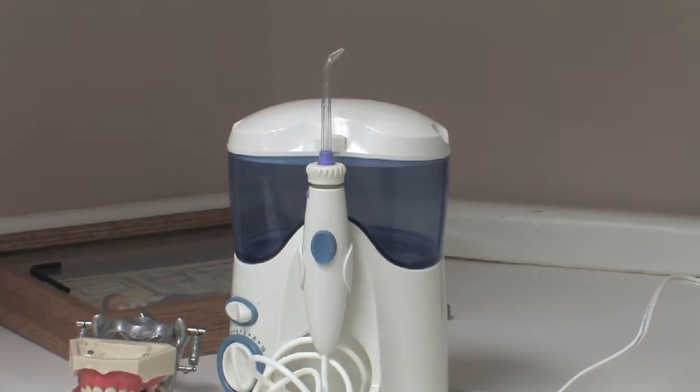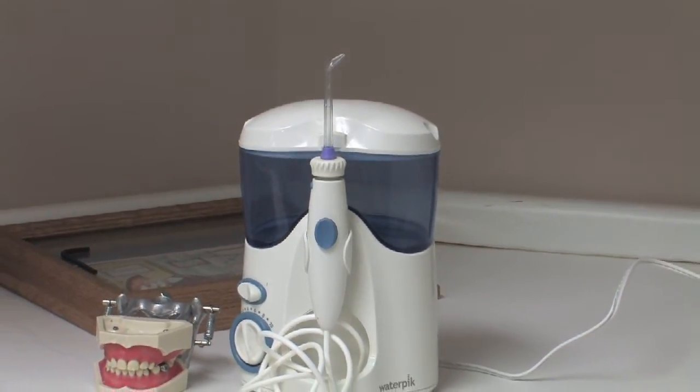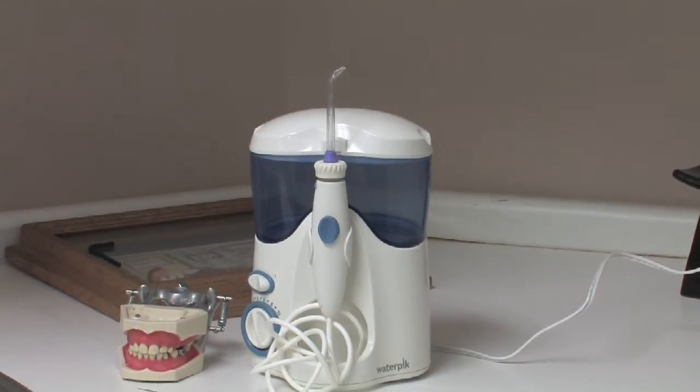The Waterpik takes it a step up and uses water pressure to make sure that not only is brushing and flossing adequate, but to ensure that things that would collect around spots you wouldn't normally reach will often be removed by the Waterpik.